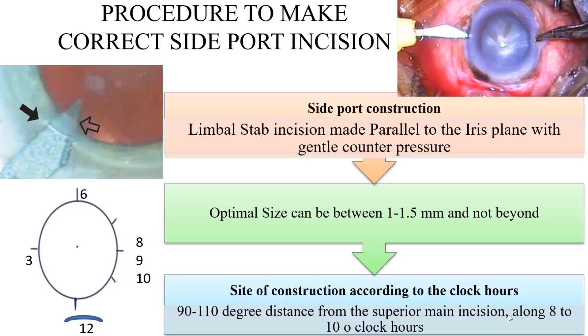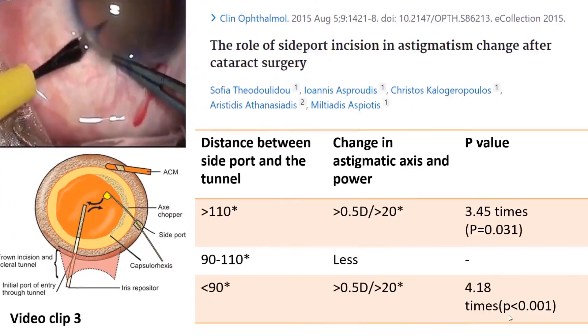The site of construction can be anywhere along 8 to 10 clock hours, preferably 90 to 110 degrees distance from the superior main incision.